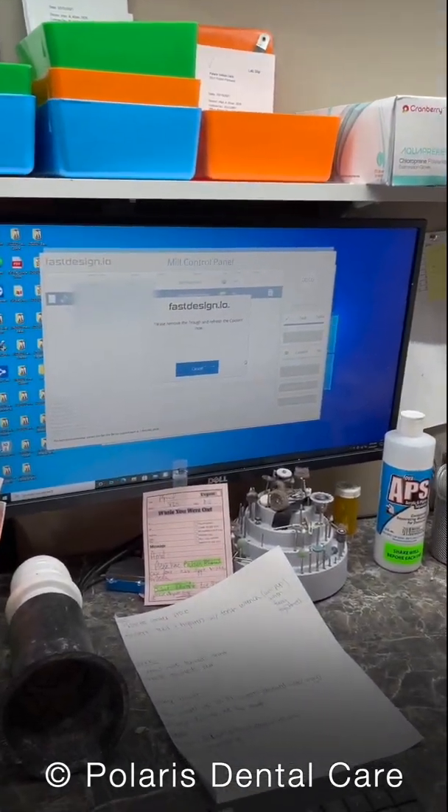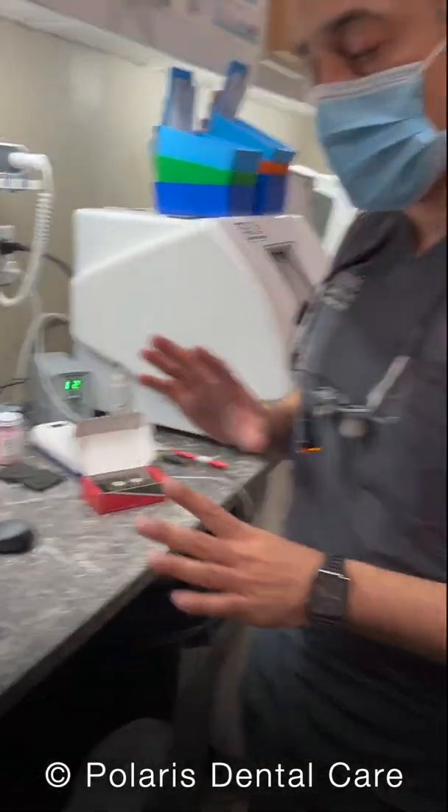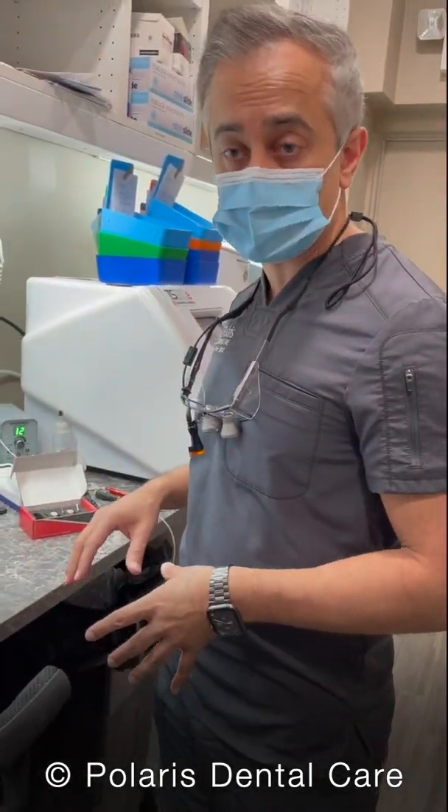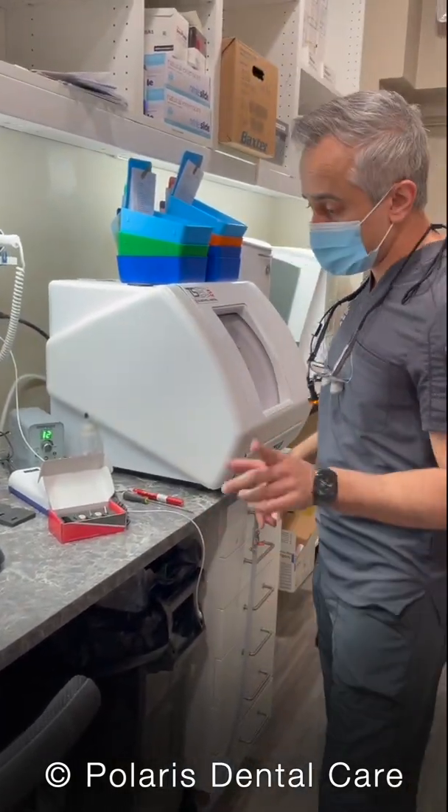This is also asking us to change the coolant. You don't have to change the coolant every single time — you get about four to five mills before you have to change it. The computer will tell you when you have to do it. This part can get messy.